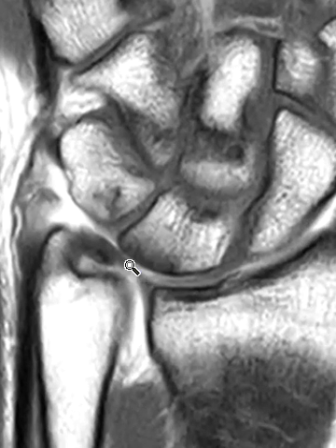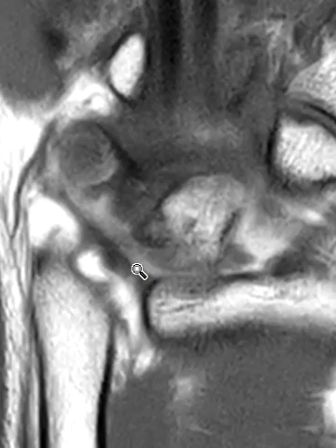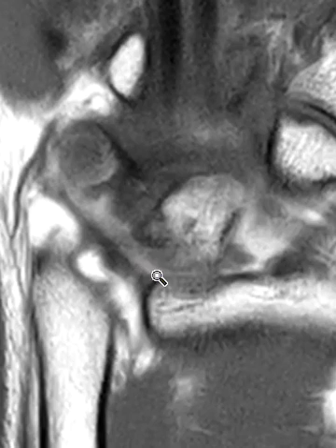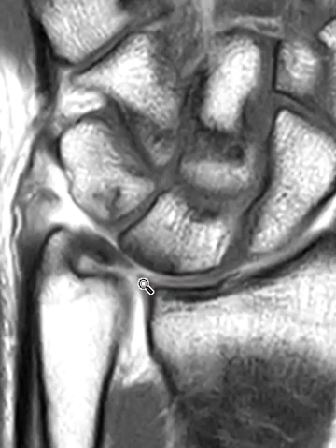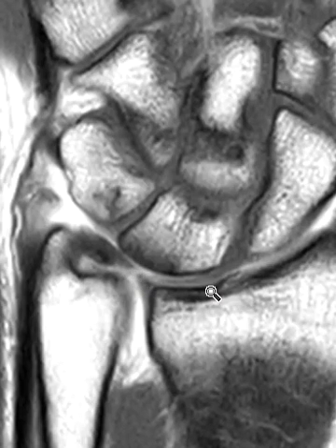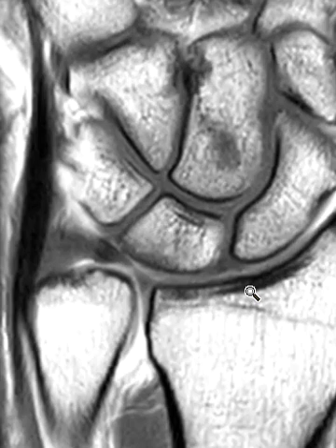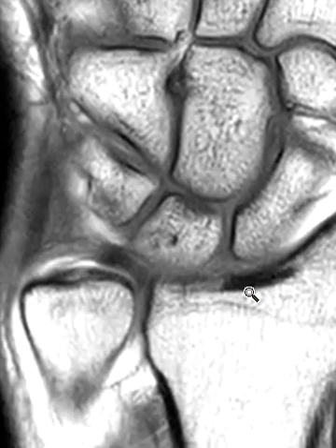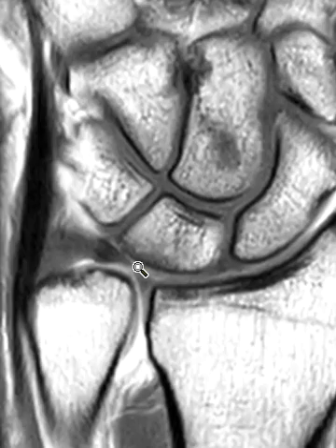This is the central disc. If we go one cut towards the palmar aspect, we see the palmar band here, this gray area. If we go back to the midline, we see the full thickness perforation of the central disc right there. If we go one or two cuts this way, we see the dorsal band over here — it looks intact.